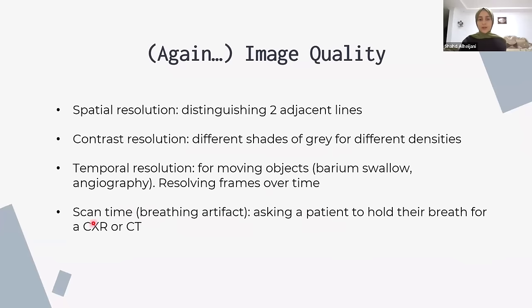So here, for the scan time, you need to keep in mind that in some modalities, sometimes when you want to X-ray the patient or you want to do anything, CT, MRI, you'll ask the patient to hold their breath so you can better visualize. So for example, if any of you have gotten an X-ray before, they ask you to take a deep breath and then hold it. And then they'll start taking the image. But you have something called a breathing artifact. So the patient can't hold their breath for a long time. So you need to keep in mind that the scan time also will result in some issues.